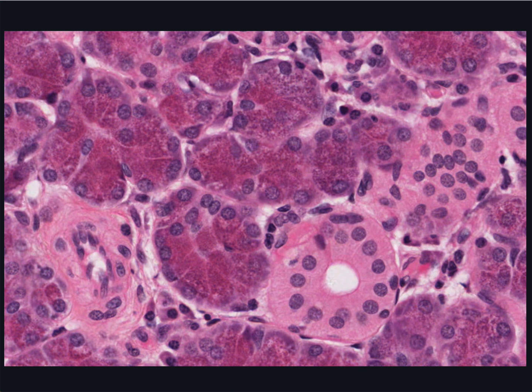Within the lobules, the secretory acini are easily distinguished from the ducts. The secretory acini have round, basally located nuclei, and the apical half of the cell is filled with secretory granules. These appear eosinophilic or acidophilic as they contain secretory proteins.